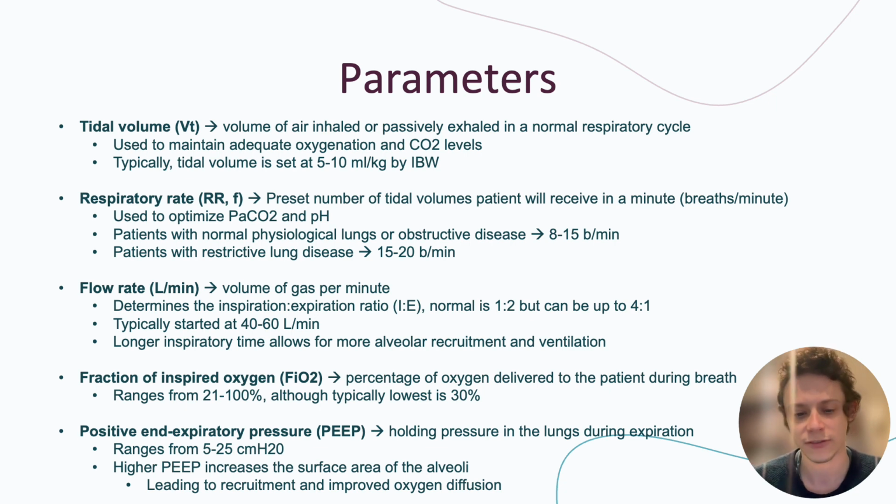Next is the fraction of inspired oxygen, also called FiO2. This is the percentage of oxygen being delivered to the patient during each breath. This ranges from 21 to 100%, although typically the lowest FiO2 that can be set on a mechanical ventilator is going to be 30%, because 21% is actually what we breathe in normal air. Right now, you're breathing 21% FiO2.